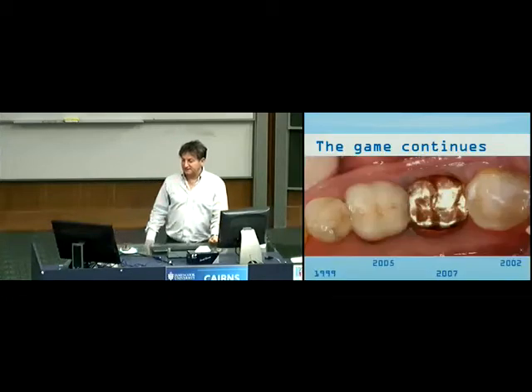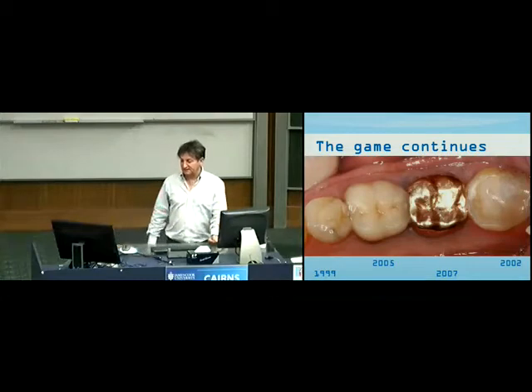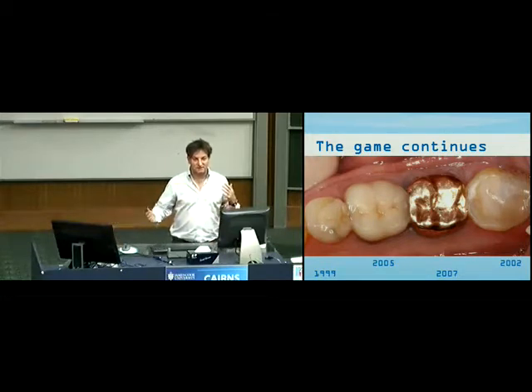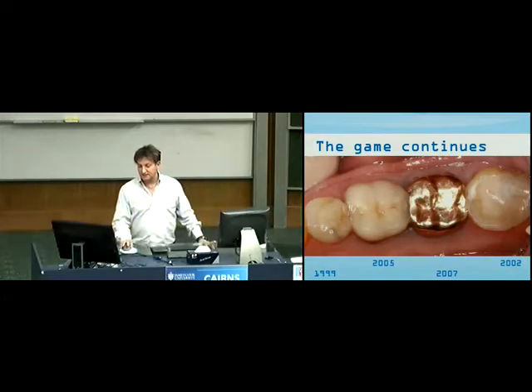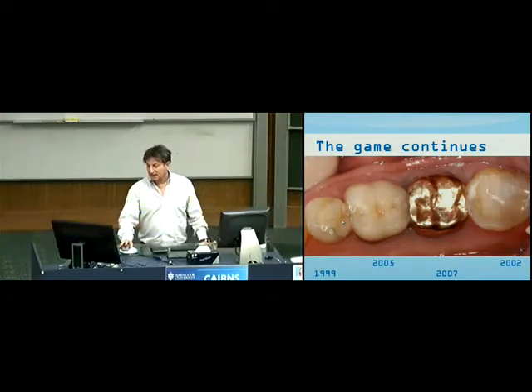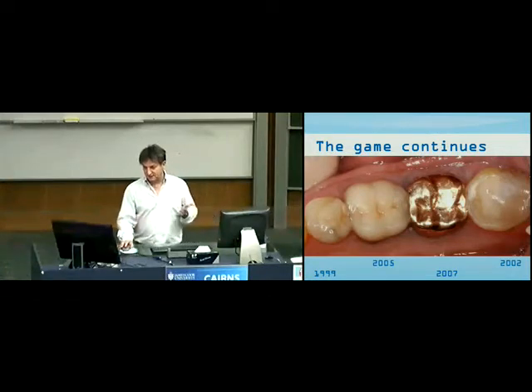The other day, at a friend of mine's place, an architect, I took a photo of some of the work I'd done a few years ago. I noticed it was almost like a history book of the dentistry I'd been doing, with all the different types of materials. This is a Ceramage inlay that I did. It's been quite successful. And this is just a standard composite, a gold crown and a PFM. Look, they've all worked. None of them are failures, but the question is, which one was most suitable for the right application?